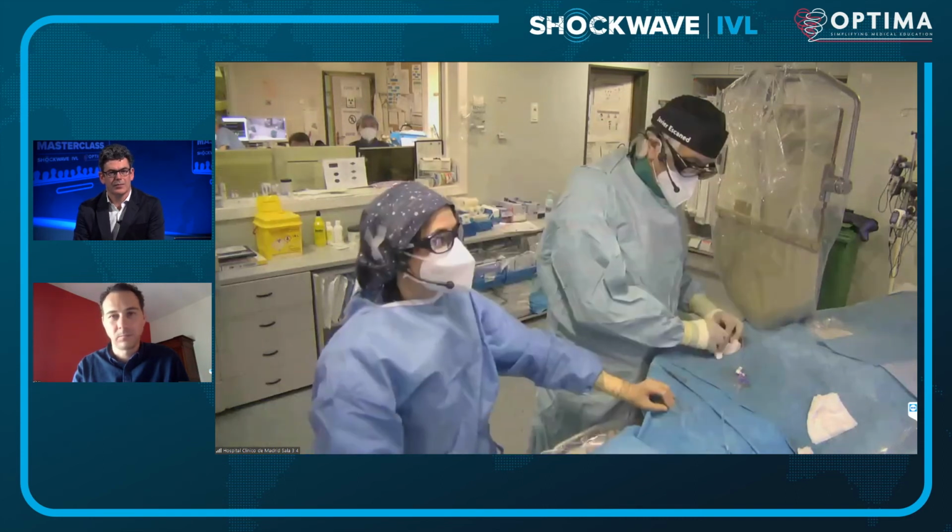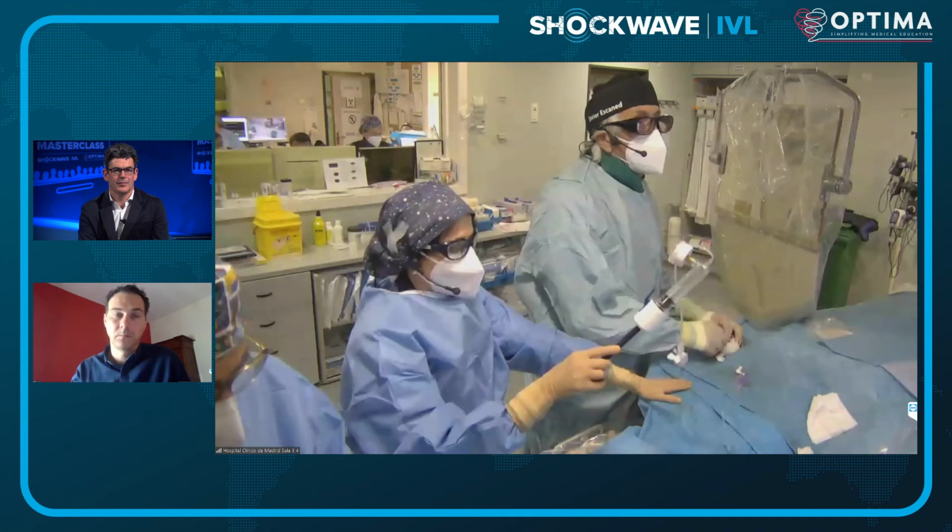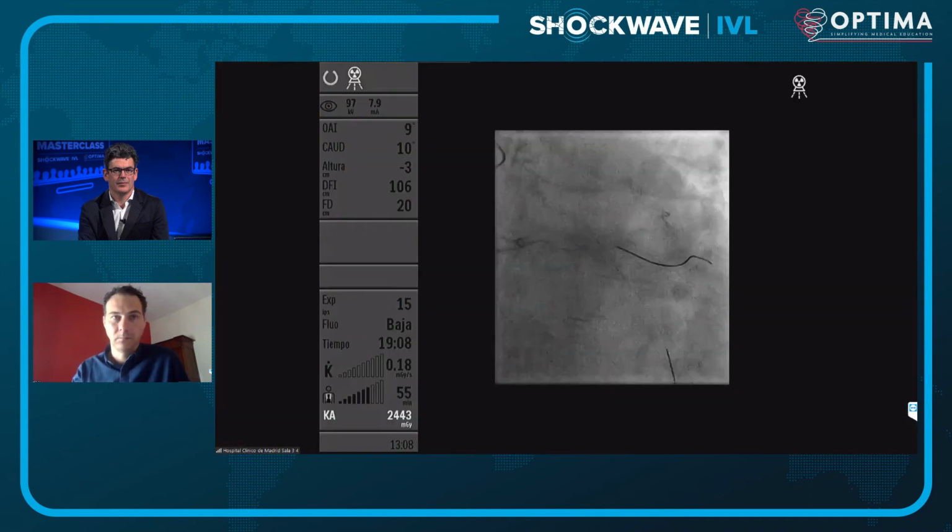Yes. The contemporary stents are not designed for receiving longitudinal forces. They're very good in radial strength, but you can damage the whole thing. Good. So once we do this, we'll make an OCT and see what happens. Yeah, this is the 4-0.